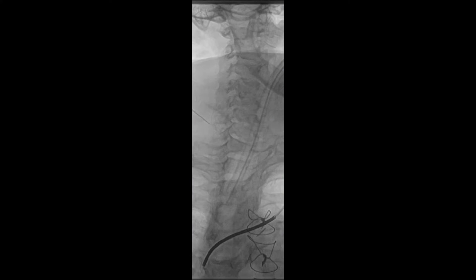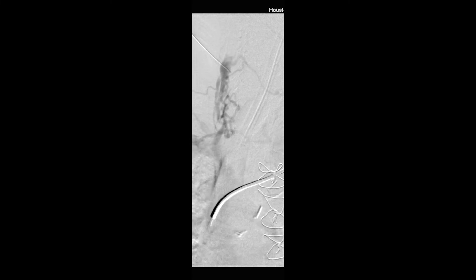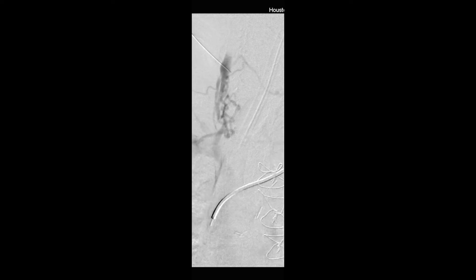The procedure began by obtaining access to the right internal jugular vein with a micropuncture needle under ultrasound guidance. Passing of a 0.018-inch wire into the SVC was unsuccessful. A central venogram revealed significant right-sided central occlusion as well as a retained pacemaker.